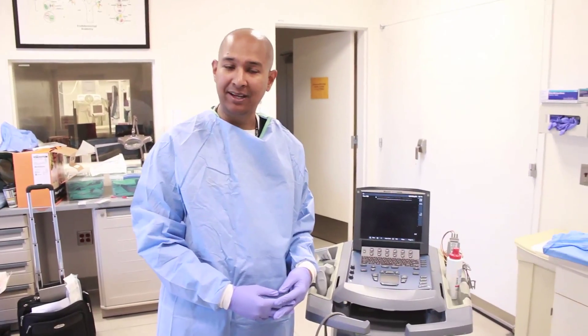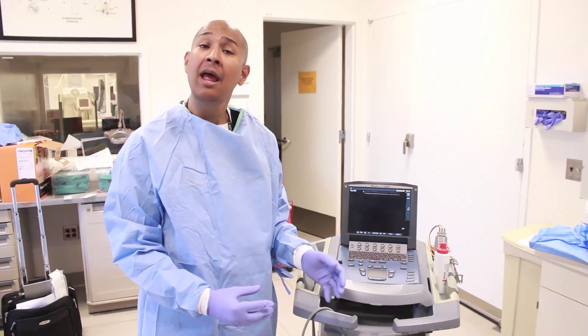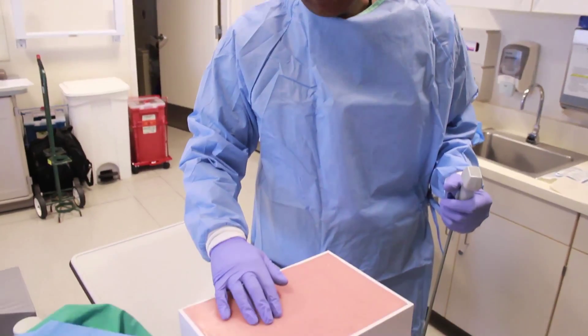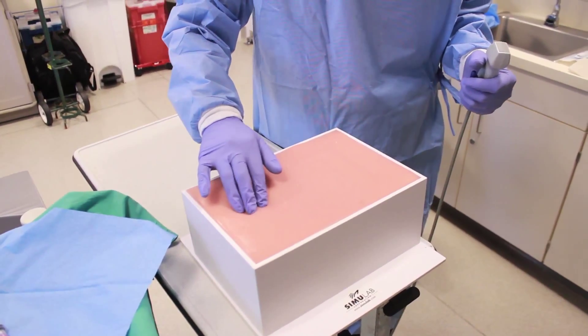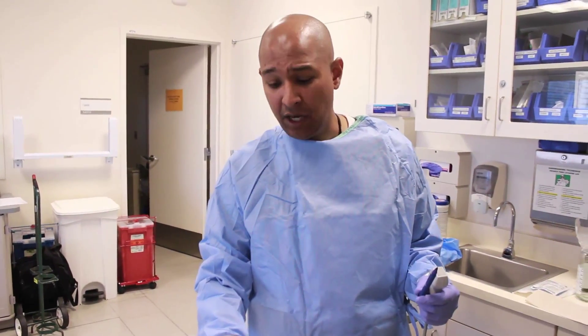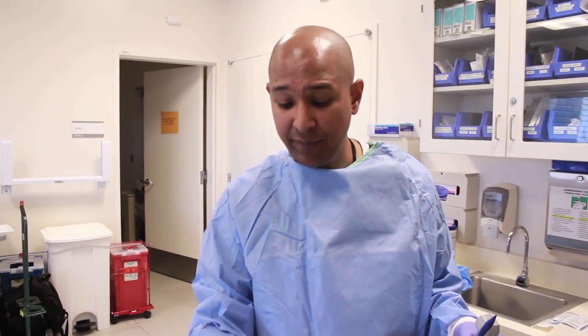When finding the optimal place to position the pleurex catheter, I use the ultrasound. The ultrasound will show you where the best pocketed fluid is located. I would palpate the ribs — traditionally the pleurex is placed between the 6th and 7th intercostal space — and use the ultrasound to optimize placement. After finding the optimal place, I need to mark where my tunneling entry point will be. You can tunnel towards the patient's umbilicus or make a 5-centimeter mark perpendicular to the initial X that you've marked.